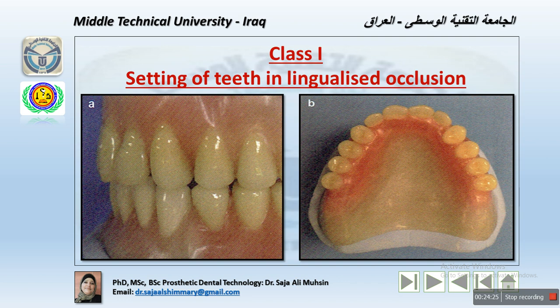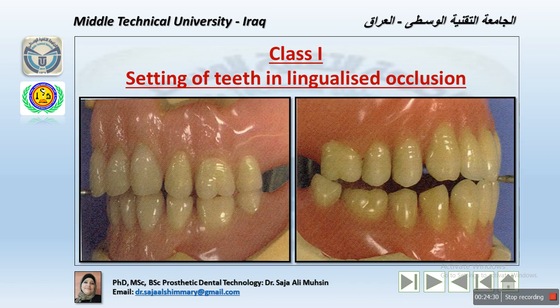The lower canine is then positioned to occlude with the central fossa of this tooth by angling the premolar outward a little more than usual for a canine. It is possible to hide the palatal cusp and make this tooth, to all intents and purposes, a canine. This usually has no detrimental effect, of course, on aesthetics.